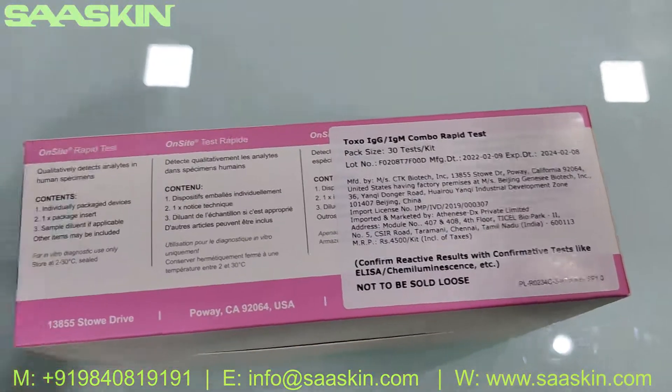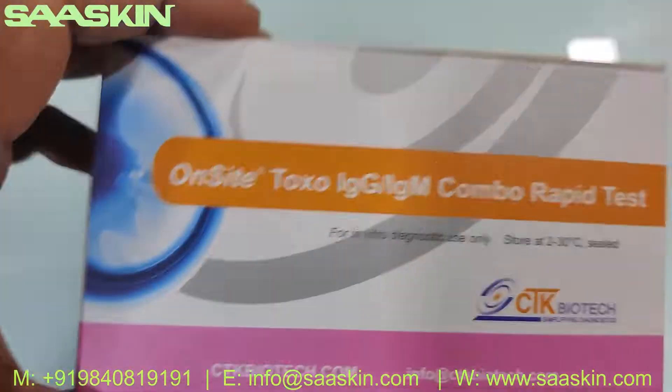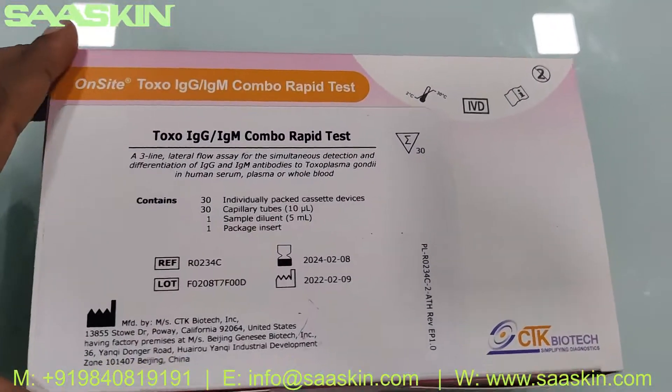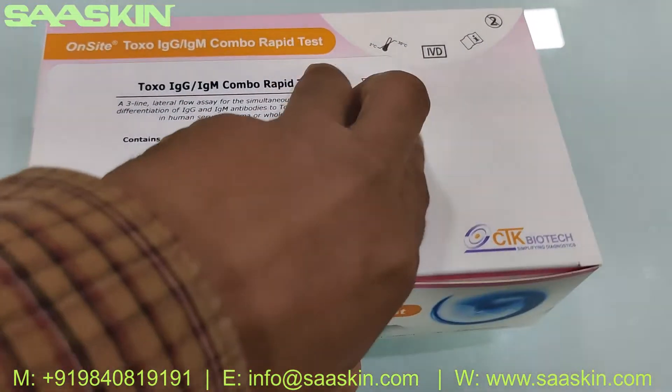This is what the box looks like — let me go around the box. On-Site Toxo IgG IgM Combo Rabbit Test, same on the other side. Let me open this.